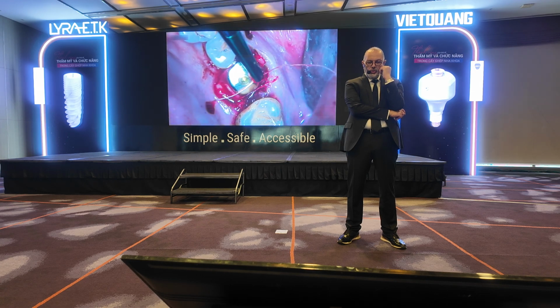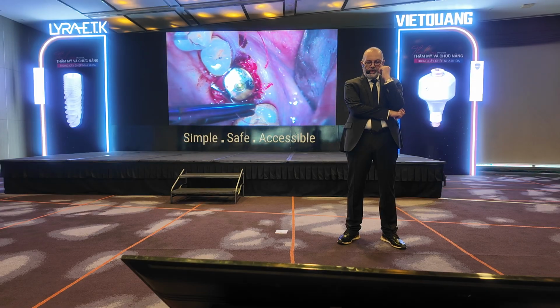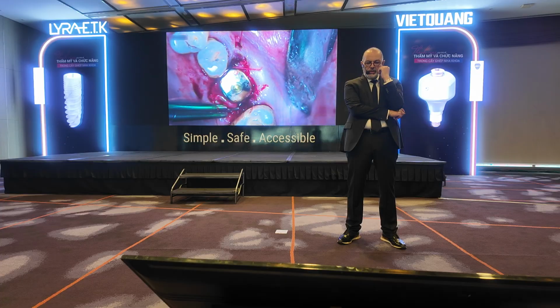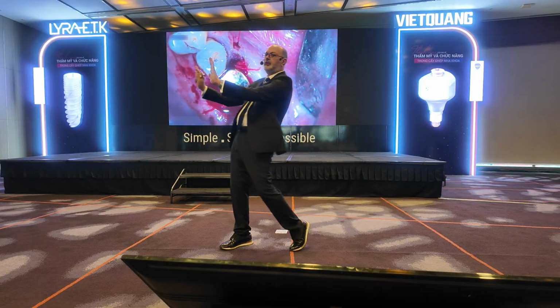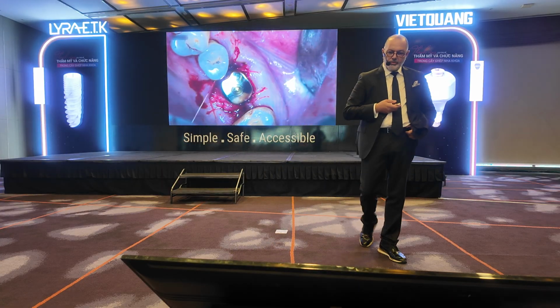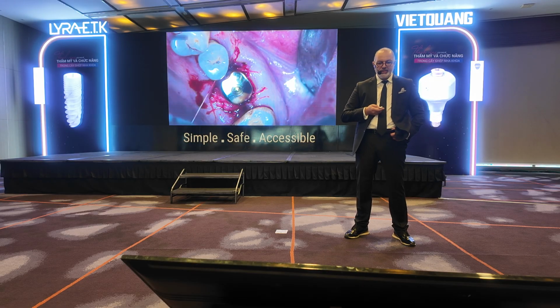You see, I go 2 times and in the middle, in order for me, when I tighten the sutures, I have all the soft tissue wall coming on the iPhysio. It's very important to have this sealing.